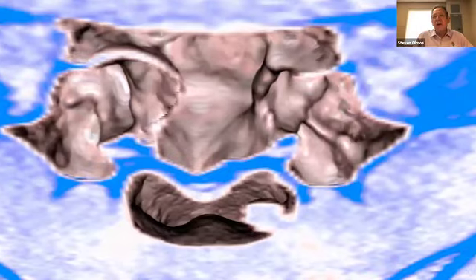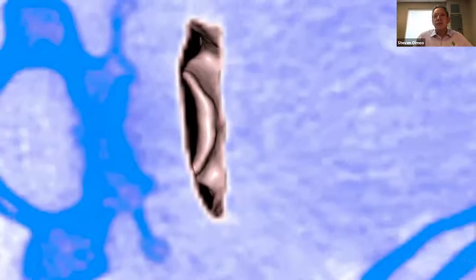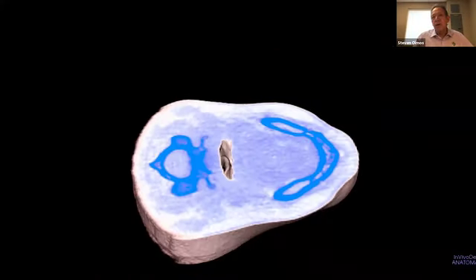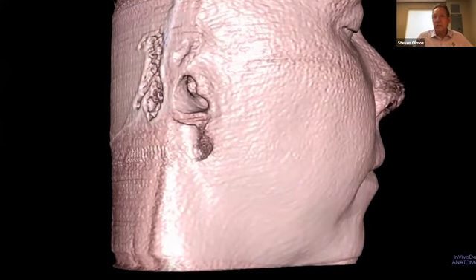We look down the velopharynx all the way down to the oropharynx to be able to discern whether or not we have patency, especially when we're treating people for these problems. We need to know whether we've affected them. So this is a really important part of the process, and very difficult to deliver this kind of care without imaging, and I wouldn't attempt a case without it.